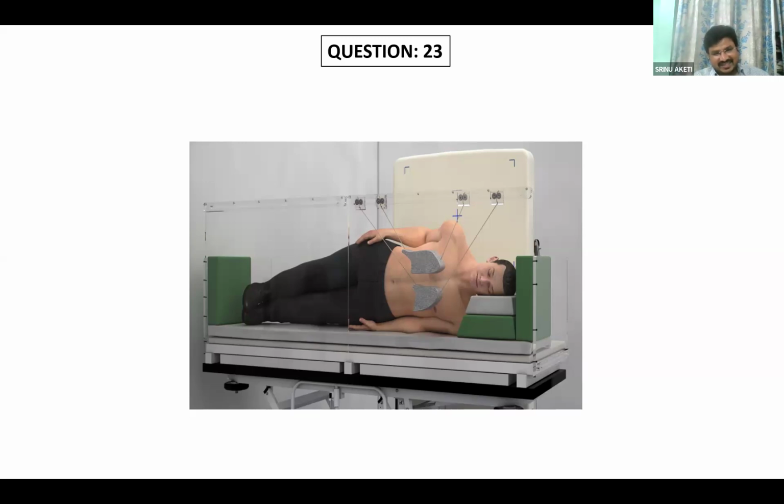How can you say that? This is bilateral. Even the patient lying down in supine position is also bilateral. Standing APPA is also bilateral. In this, we can actually consider midline dose. See, dosimetrically, APPA is the best one, because the APPA separation is very small, so you can deliver a more homogeneous dose. Your aim is to deliver a homogeneous dose throughout the patient's body. Dosimetrically APPA is good, but standing APPA is very difficult, so people will select the supine position. But in the supine position, patient comfort is more.